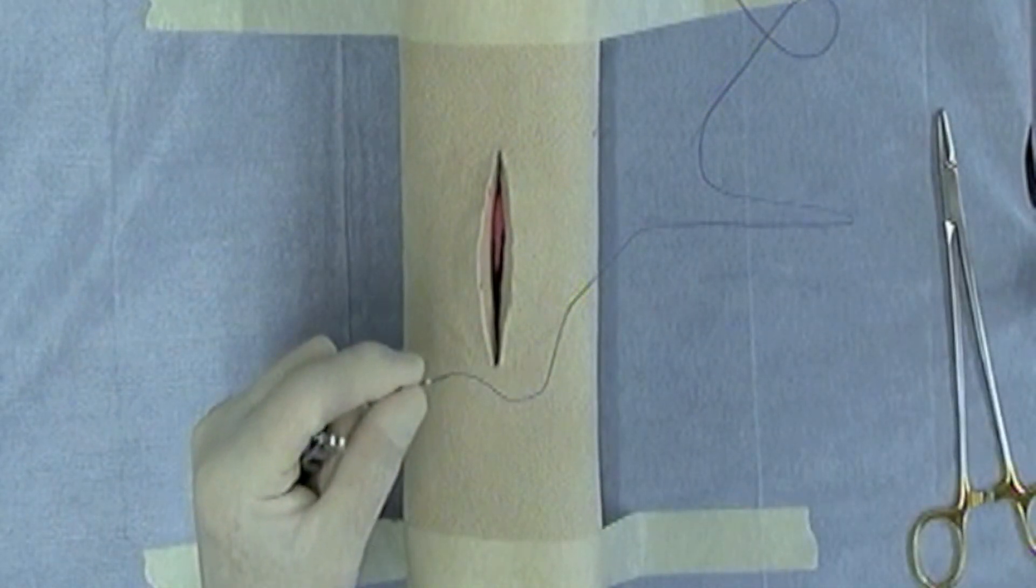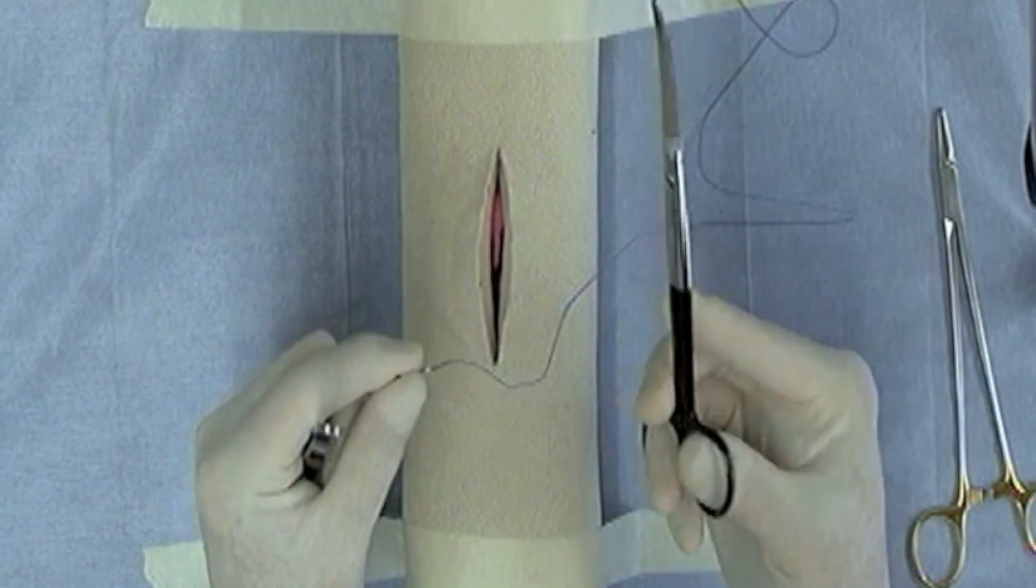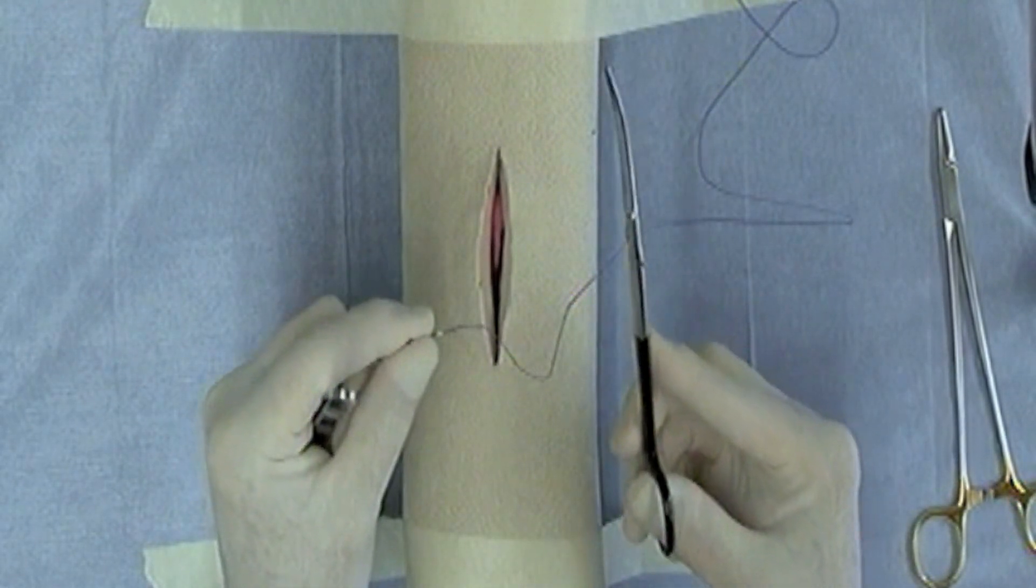And then later to cut the suture, you'll be using some form of scissors such as I have here, which is a curved mayo scissors.